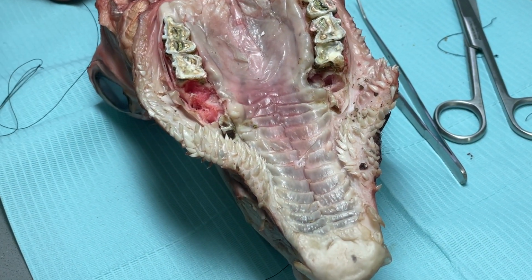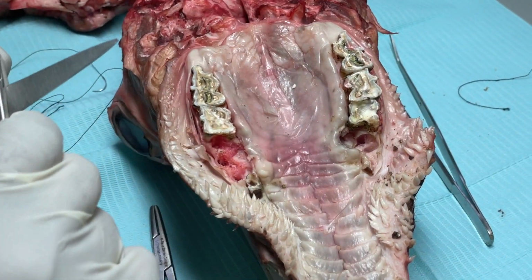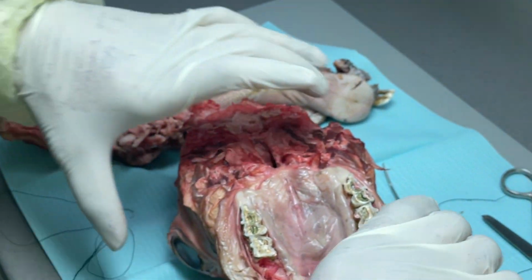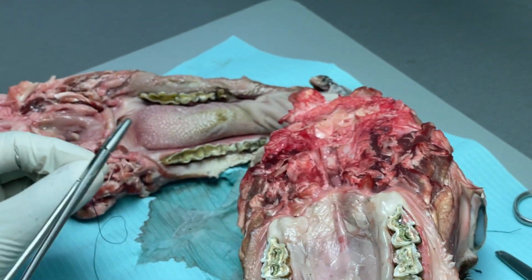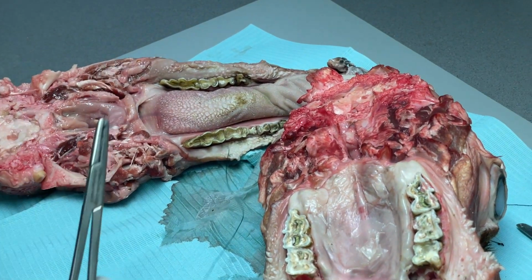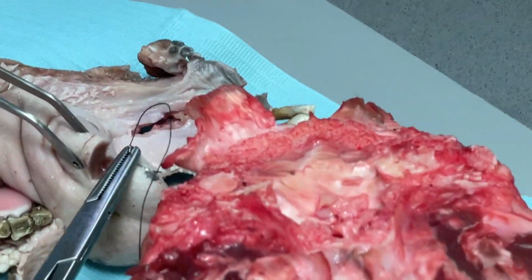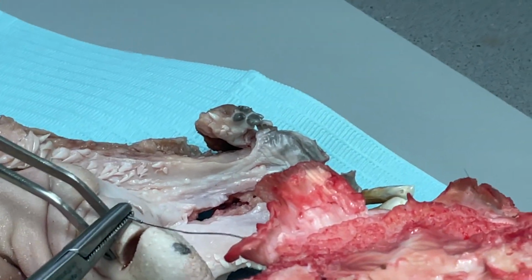Now we need vertical mattress. Vertical mattress. Let's make one. So here, it's a deep wound. Now this is a deep wound, correct? Yes. So the first suture will go a deeper bite, the far one. Yes, it will go a further bite.